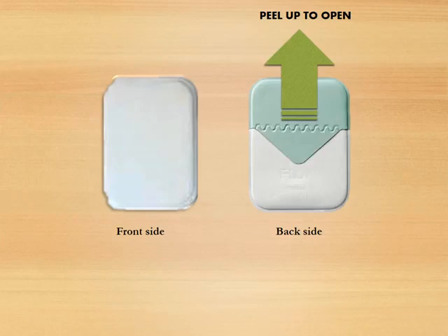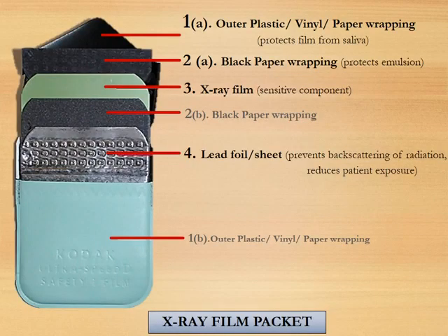The x-ray film packet has a front side which is white in color and a back side which has a triangular flap. This triangular flap should be peeled up to open the x-ray film packet.